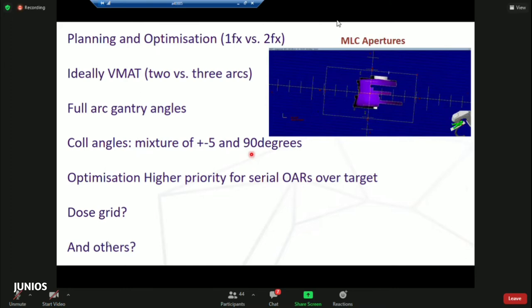And for the dose grid setting, we have to go down to the smallest, the finest setting, if you wish. And for the others, that includes any moving OARs or any uncertainty in the surrounding organs, you had better put some PRV, for example 3 millimeter as an example, and constrain to that rather than the direct or intact OARs. Also, if you have a bowel structure, it's better to make a bowel bag rather than an intact structure, so it can move to different places between simulation and treatment.